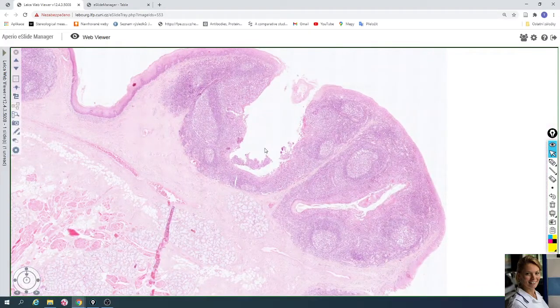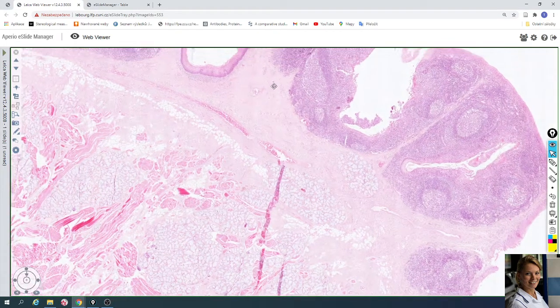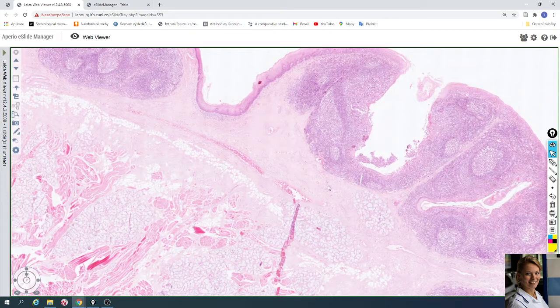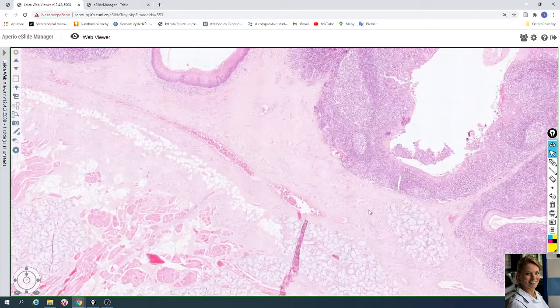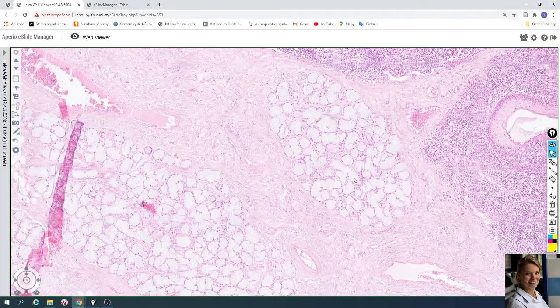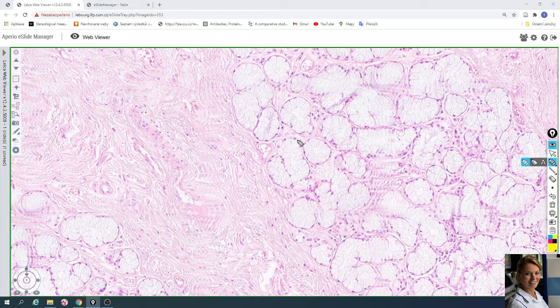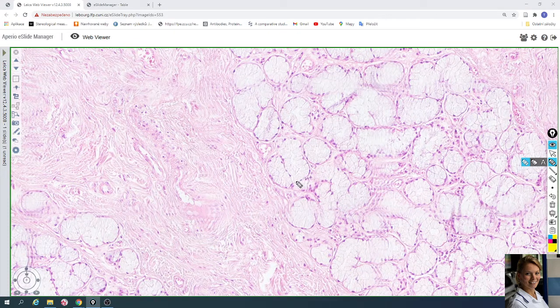Under the lamina propria, with the lymphatic follicles, you can find a fibrous capsule with blood vessels. Under the fibrous capsule you can find mucous glands. Here you can see mucous cells with darker nuclei located in the basal compartment of the cells.